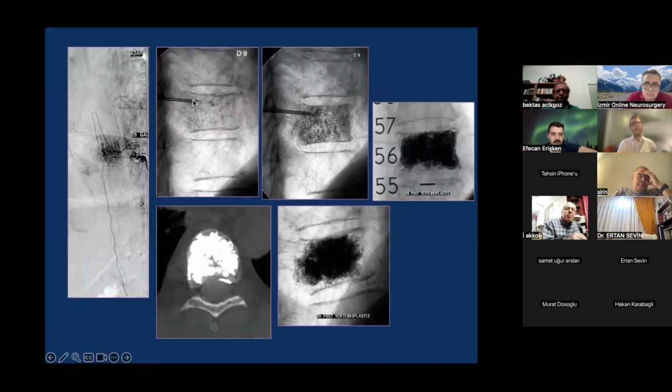Then, under general anesthesia in prone position, we will put a bone needle in the posterior aspect of the vertebral body, and we do a phlebography to see where the alcohol will go, and we afterward inject some pure alcohol in the anterior epidural component, and 2 weeks after we do a vertebroplasty of the vertebral body, and this prior sclerosis with alcohol prevents the migration of the cement in the anterior epidural space.